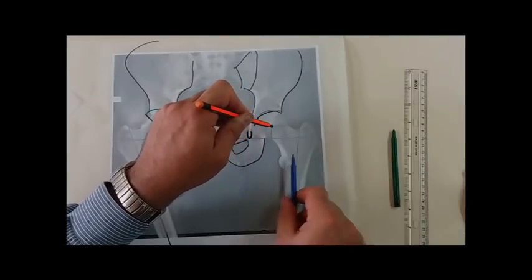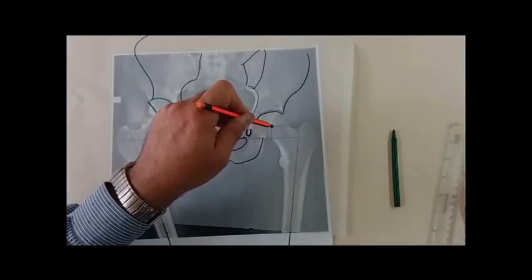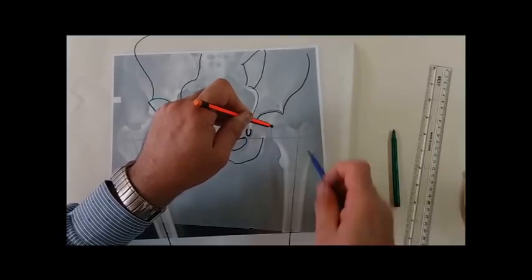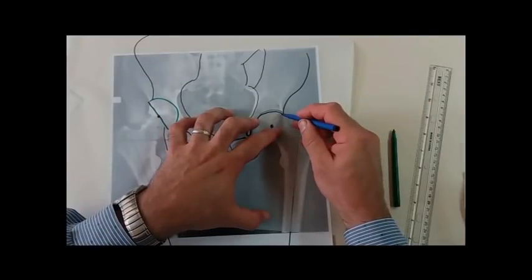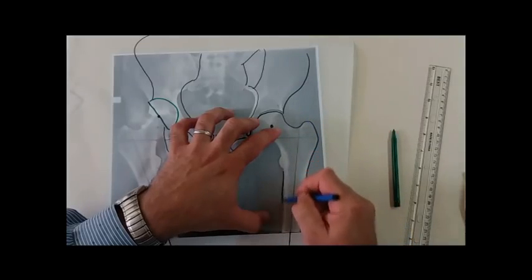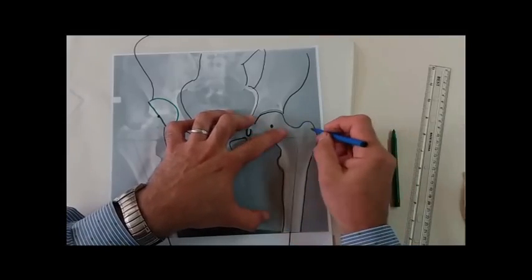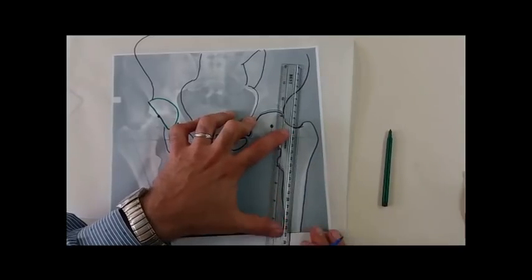I shouldn't keep this tracing paper like that. The edge is not parallel to the medullary line. I rotate the paper till it's parallel. So this line is parallel to that line. By doing this, I will draw the whole femur. Fix this paper, and I will try to draw the whole femur. Still I am in the normal side. I will draw the whole femur, lesser trochanter, the neck, the saddle area, of course, as well, because this will guide my measurement for the offset.